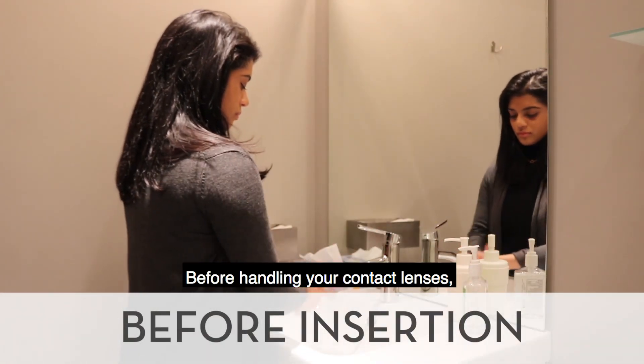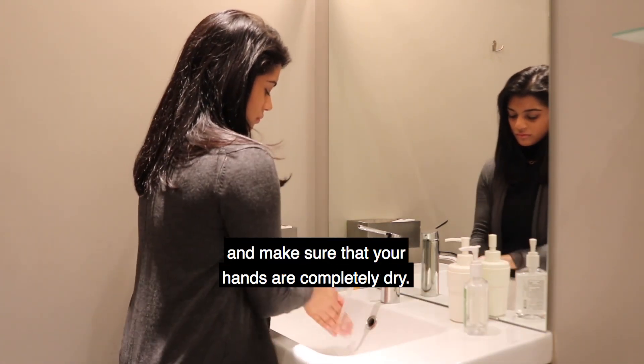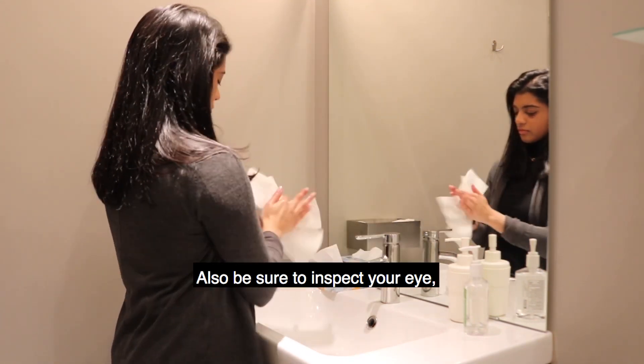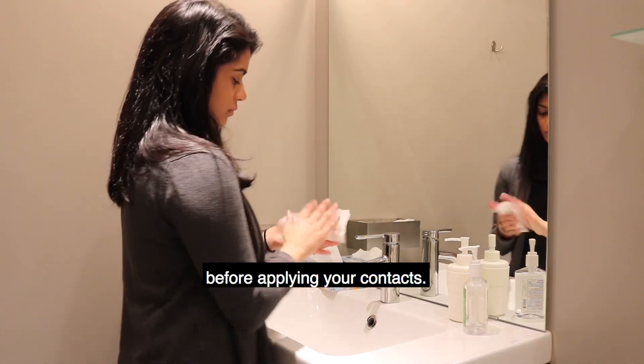Before handling your contact lenses, it is important that you wash your hands thoroughly with mild soap and warm water and make sure that your hands are completely dry. This will be a huge help when you are inserting the contact and it will give you a better hold or grip on the eyelid. Also be sure to inspect your eye and make sure there's no irritation, redness, or pain and that your eyes are healthy before applying your contacts.